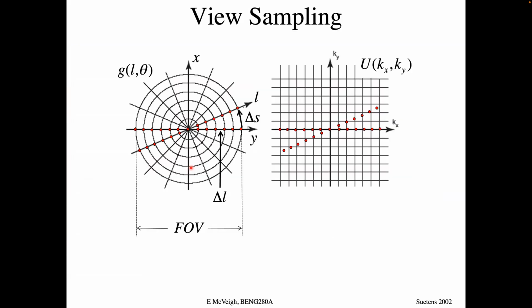So let's look at that in terms of a diagram where we have the sampling spacing, or the sampling frequency, annotated. Here's my field of view in this direction, and I have a distance between each sample point on my detector.